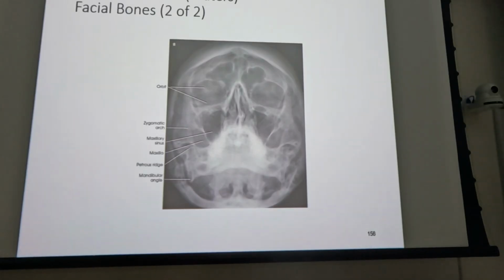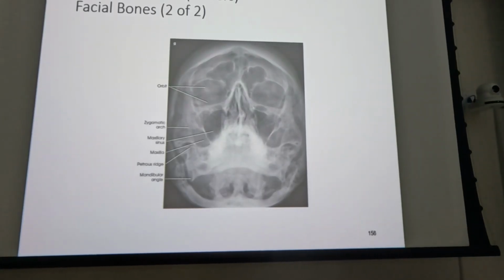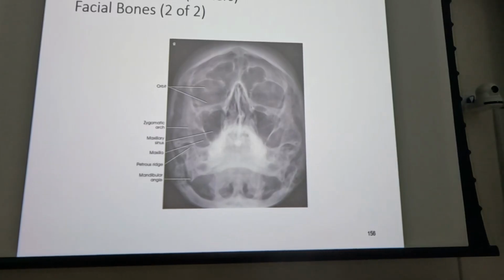Is it as ideal as maybe a Caldwell to see the frontal sinus? Maybe, maybe not. But can you see them? You think you can make a diagnosis in that big head of cauliflower right there, whether or not they've got a sinus infection of the frontal sinus? Yeah. What do you suppose that is? It's a deviated nasal septum.